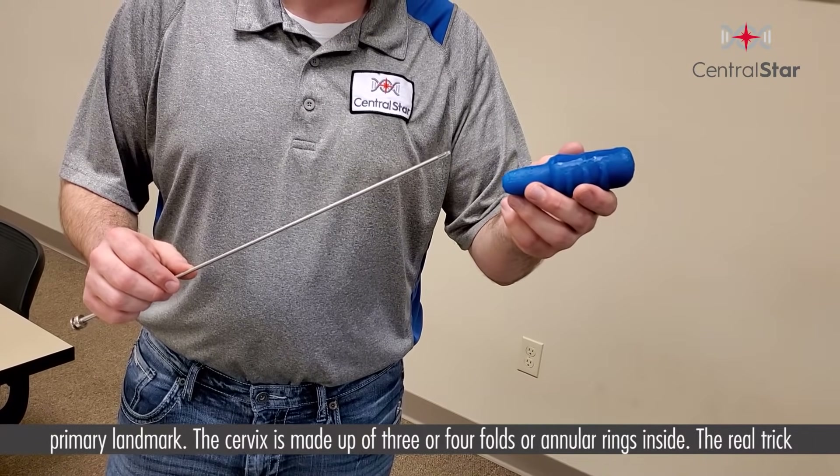One of the real tricks about this transitional process: we're using this clear sleeve here to act as the vaginal canal. As the vaginal canal transitions to the cervix, it creates what is known as the fornix. As we get to this area, the rod naturally falls into this fornix — the dead opening around the start of the cervical os, or the opening of the cervix. So naturally as the gun gets up here, it's easy to hit these blind pockets. Our goal is to minimize those dead pockets, maximizing surface area to the cervical os, and getting the rod entered into the cervix. From there, it's all about placing the cervix over top of the AI gun and getting the AI tip out the other end and into the start of the uterine body.